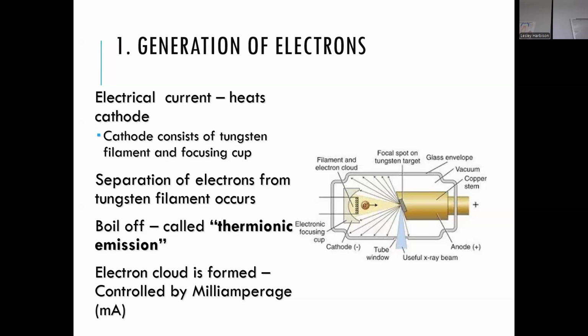Now, I don't know about other machines. You could go into an office that has an ancient X-ray tube head, and literally the old ones you could adjust MA, but they don't really make them that way anymore. They just set them at a pretty good setting and everyone's happy. But if you went to an older office, or maybe they simply had older equipment, it's possible you could adjust it, but usually they've set it at something and nobody touches it. But ours is set at 7. That will not be a test question. I'm not going to ask you what our MA is set at though.